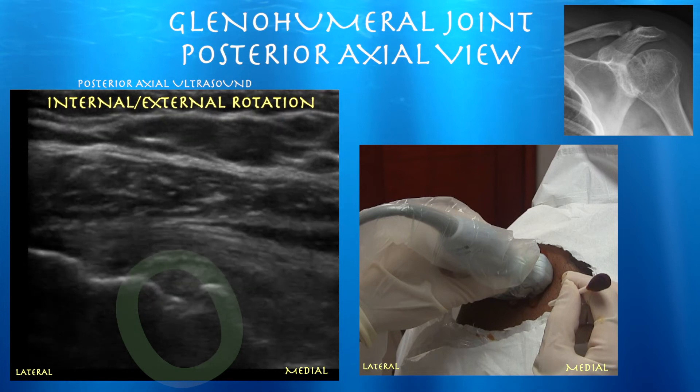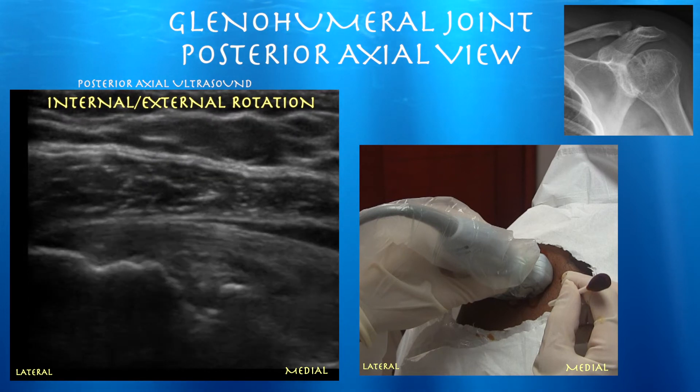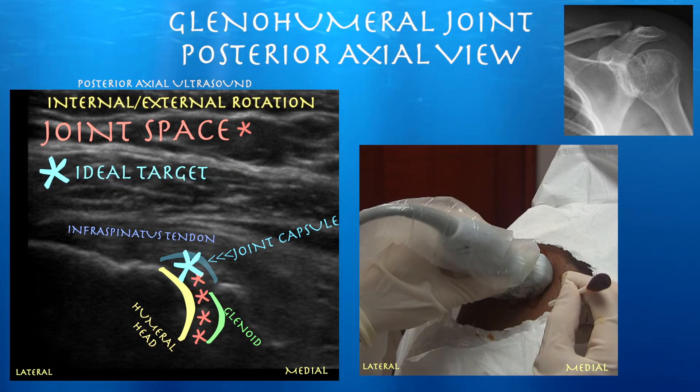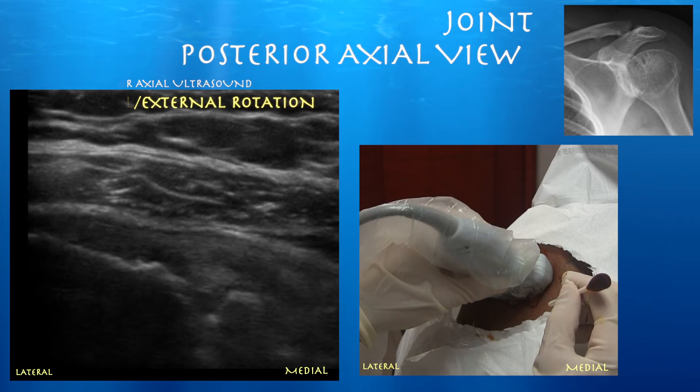Here are the structures lined out: the glenoid, the humeral head, and the asterisks marking the joint space. The nice thing about this approach is you don't have to try to squeeze the needle between the glenoid and the humeral head — you just want to get it right through that capsule which is just posterior to it.